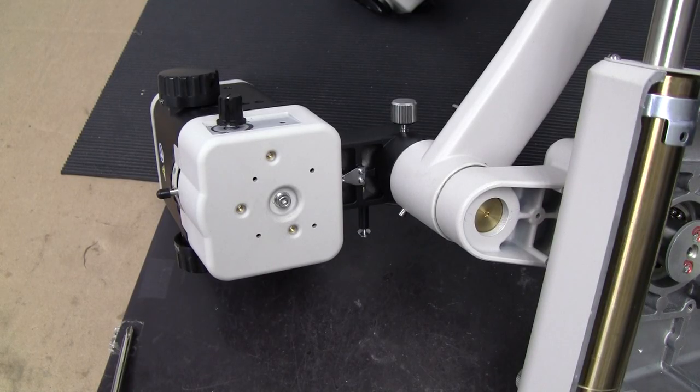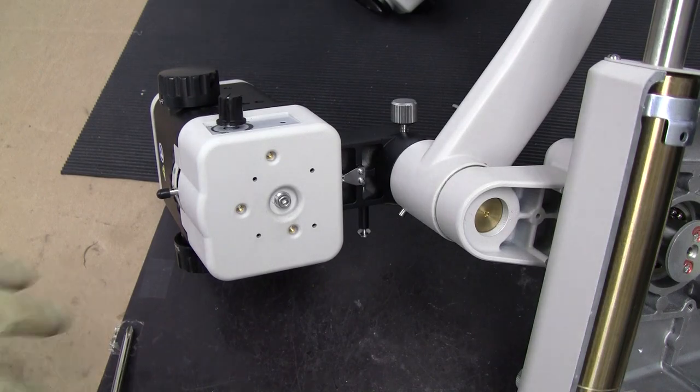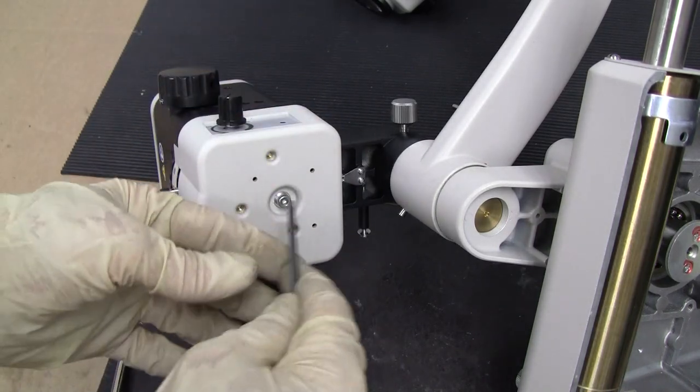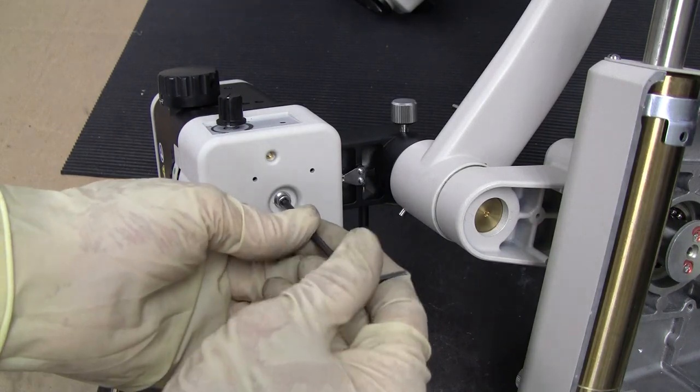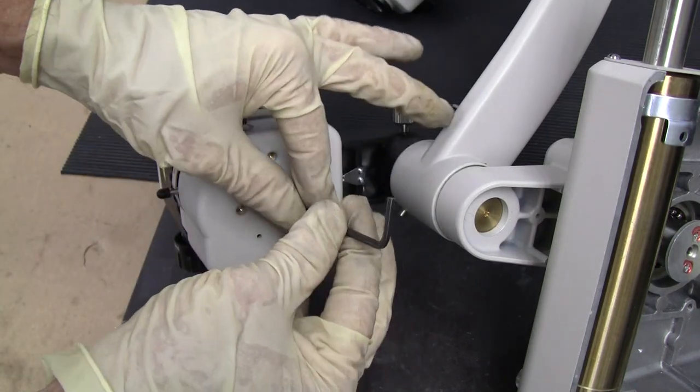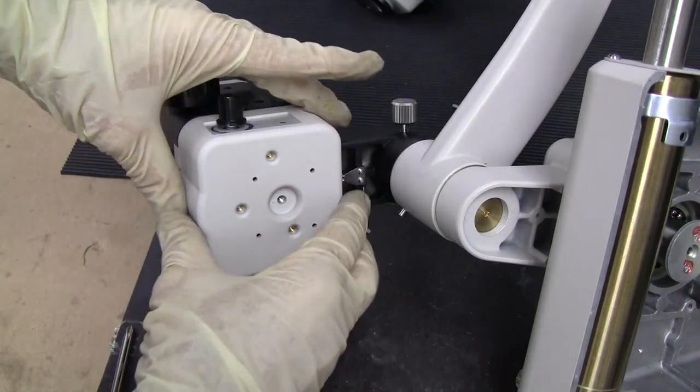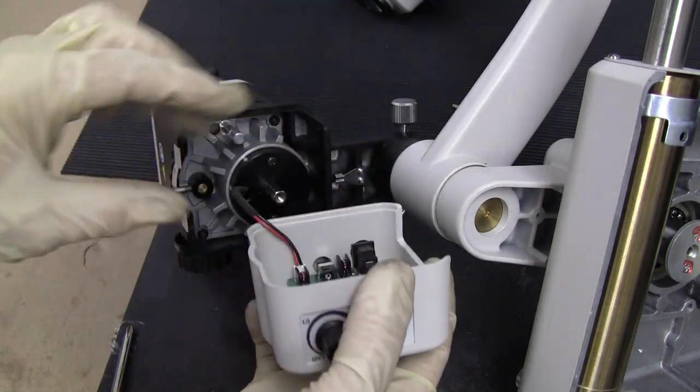I probably should have showed you this earlier, but if you don't know how to take this apart, turn it over to the side and get an Allen wrench to loosen that screw. Take it out and you can pull this off.